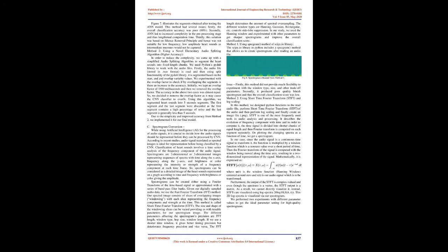The ANN comprised 2 pairs of Convolution 1D, filters equals 50, kernel size equals 10, activation function equals ReLU, and Max Pooling 1D, strides equals 8, layers, followed by a fully connected layer and an output layer with softmax activation function. Fig. 7. Audio after segmentation. Figure 7 illustrates the segments obtained after testing the ANN model.